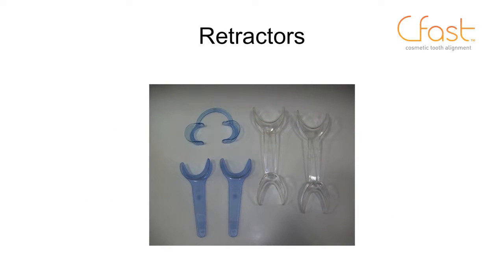Finally, we'll need some cheek retractors. My favorite cheek retractors are the individual ones that the patient will hold. The automatic ones, whilst the patient's hands are free, unfortunately sometimes what will happen is the lip will tend to drop down and obscure some of the view. So I think the handheld ones are much better and give us more flexibility.